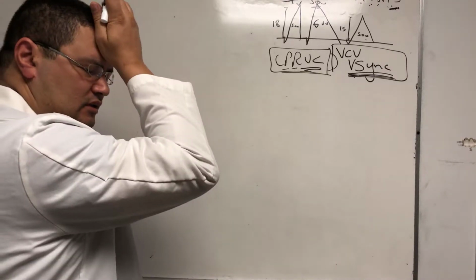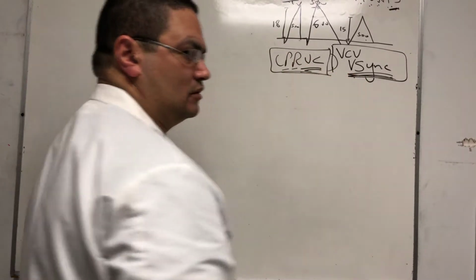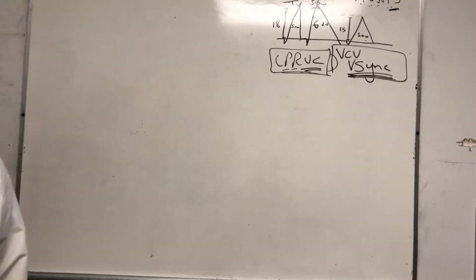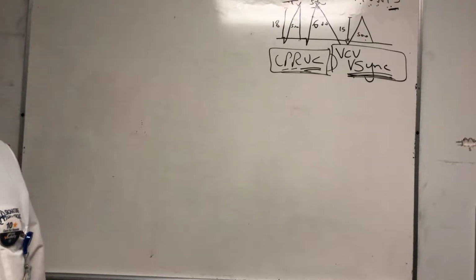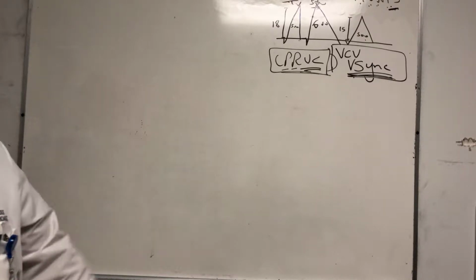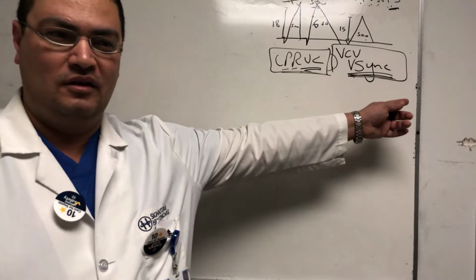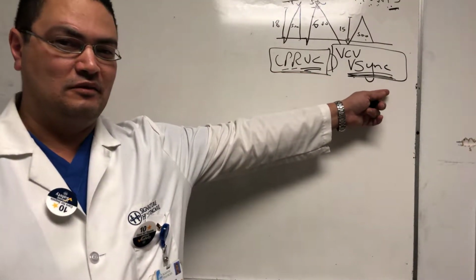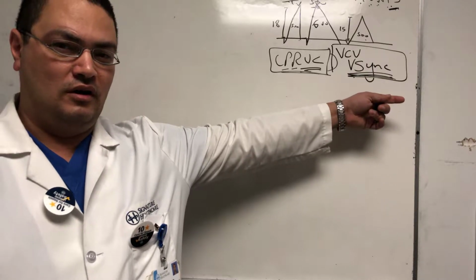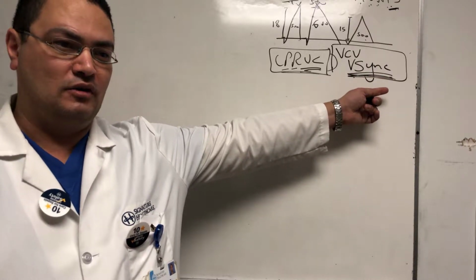And what it does is basically, when you order volume control here in Brockton Hospital, you are ordering a pressure delivered breath. Because as we talked yesterday extensively, how important or how better are the characteristics of a pressure delivered breath.